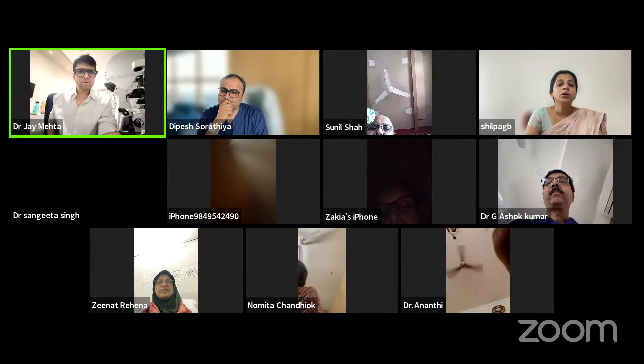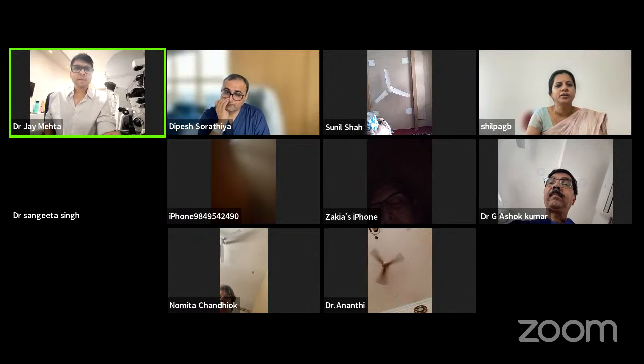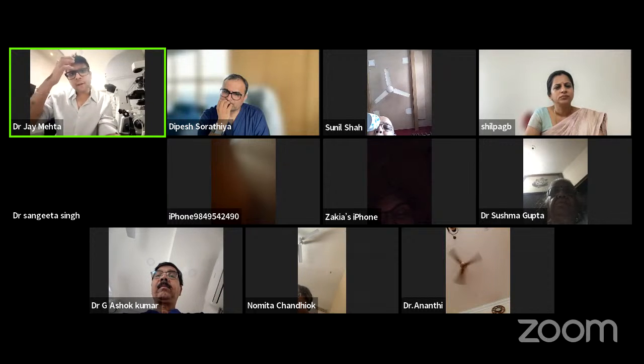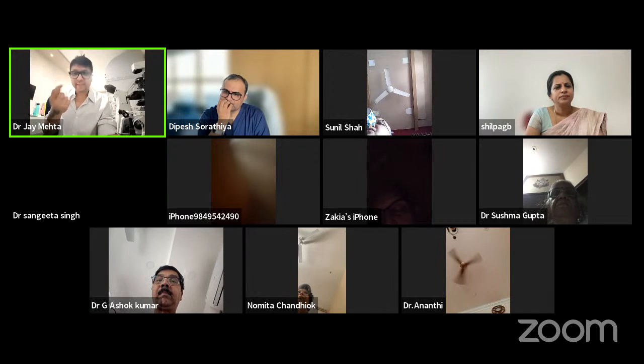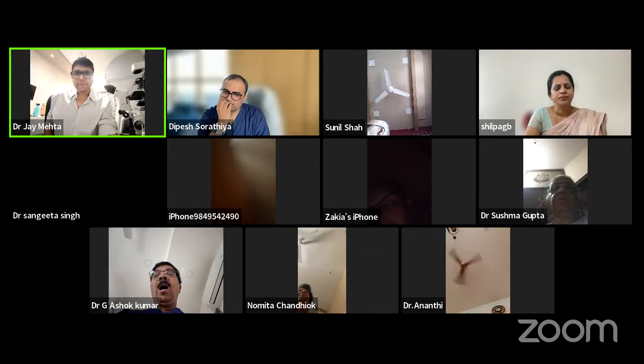But that is only if you put it in the time lapse, right? If you don't opt to put it in the time lapse, what do the clinicians do? Do they tell them when they check it on day 5 or day 3? To protect the clinicians, the government has done a very beautiful embryo record form. That form looks at the monitoring of the embryo on a daily basis, which is though not recommended embryologically. But if you fill in that data for the patient, you have static data. That means at a particular time when you assessed, this was the data available. And even that is considered to be proof in a court of law if the patient takes it.